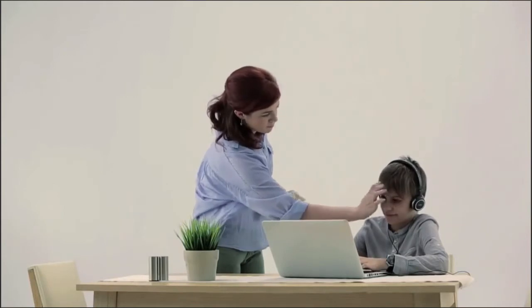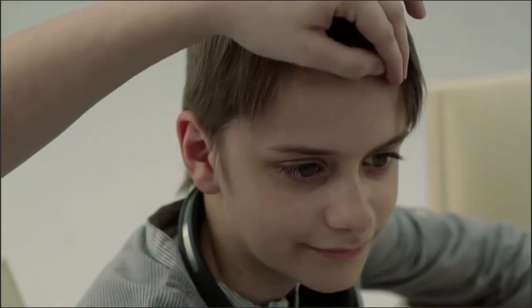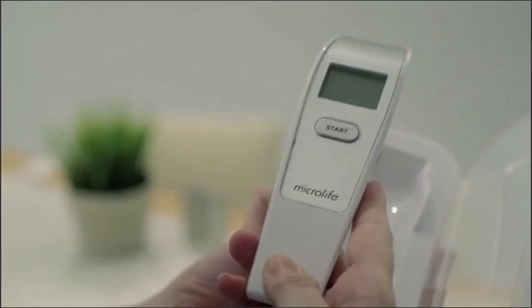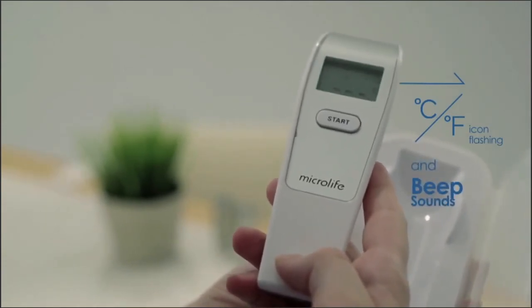Please remove any hair and sweat that may be present on the forehead before taking the measurement. Press the on-off button. When the Celsius or Fahrenheit icon is flashing, a beep sound is heard and the thermometer is ready for measuring.